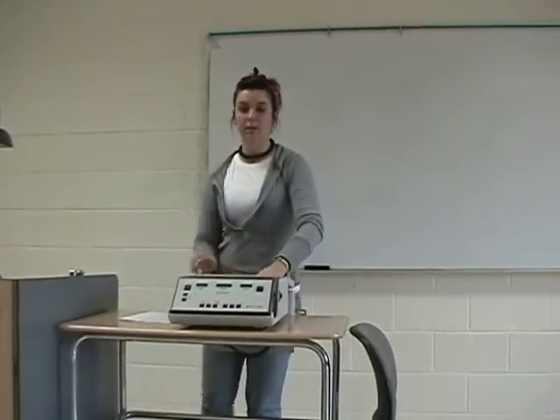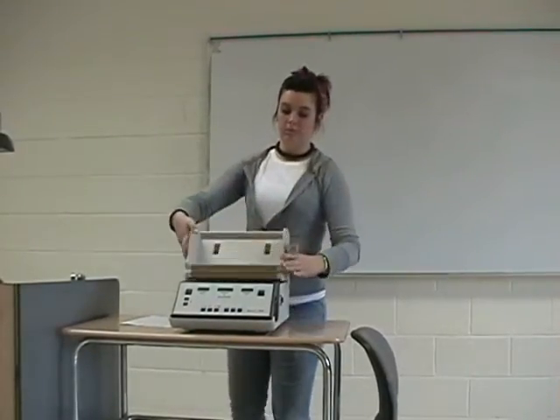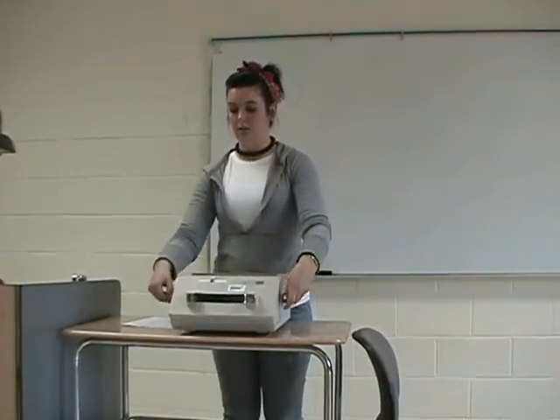Wrap this up too. Place it in the audiometer neatly. You close it. Clip it and done. Congratulations, now you know how to use a pure tone audiometer.